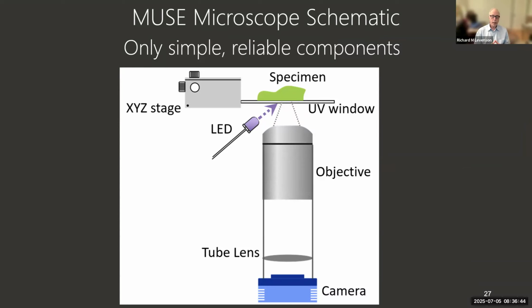It uses ultraviolet light instead of regular light in the visible range to excite or to illuminate the specimen, but the signals that come off the specimen are in the normal visible range. They can be collected with a normal microscope objective, like a 10x or 20x lens, and they can be transmitted to a standard, relatively inexpensive color camera.